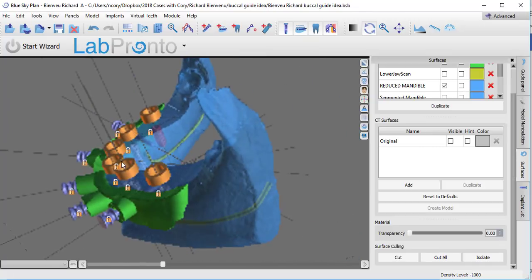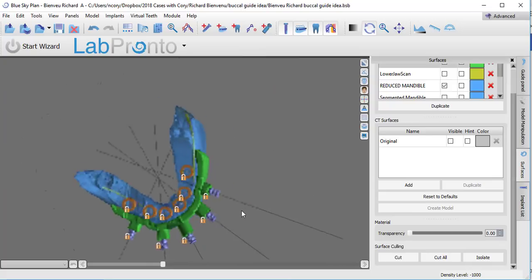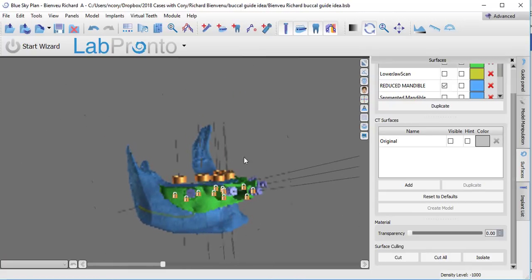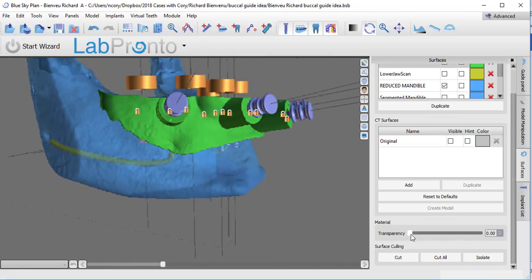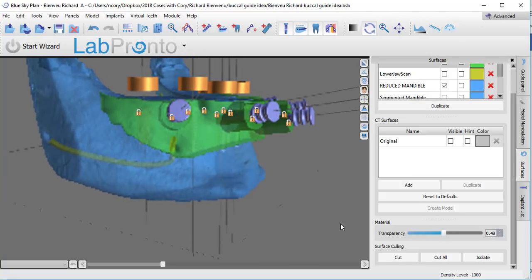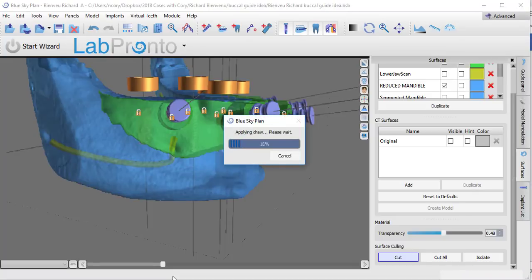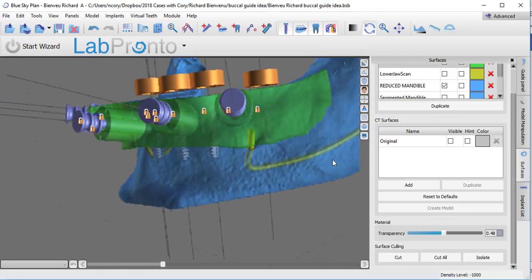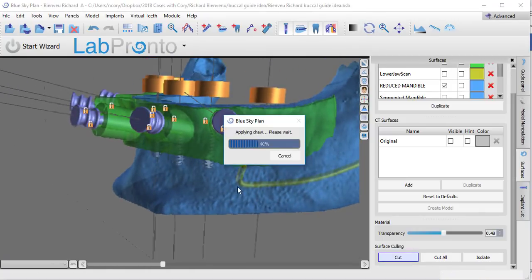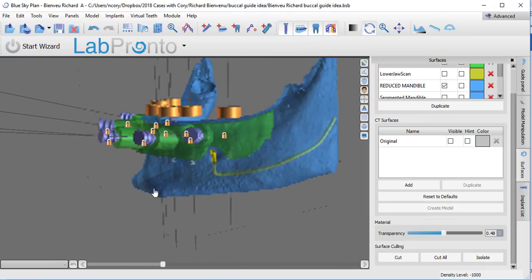Okay, so here you see the final resulting bone guide. It's going to be pretty over contoured right now, but here's where we can now go back and start trimming on this a bit. So if I turn the transparency back a little bit more where I can see the nerve and such, we obviously want to stay clear of the nerve. So this time I'm just going to use cut. I don't want to cut all here. So I'm going to just come in and swoop up and over the mental foramen, giving plenty of room. Come and do the other side as well. And that should take care of it.